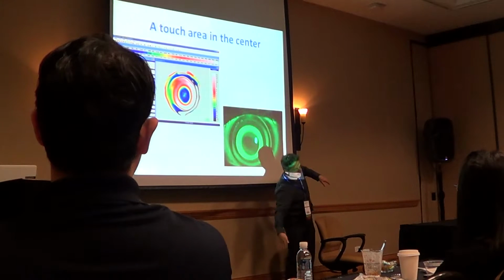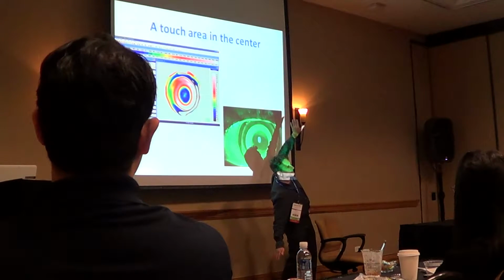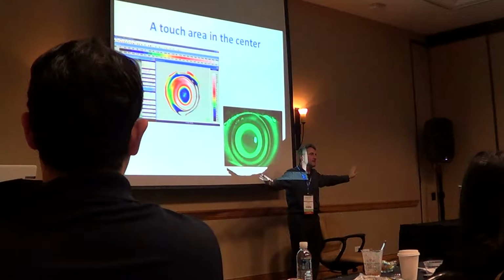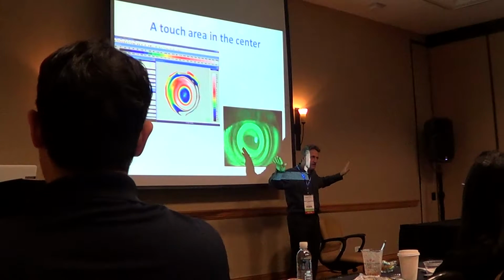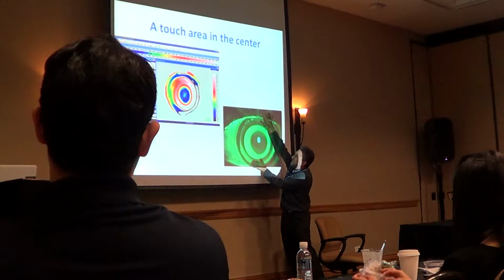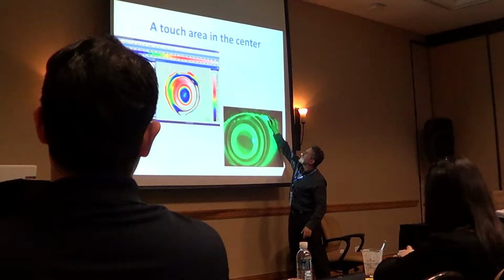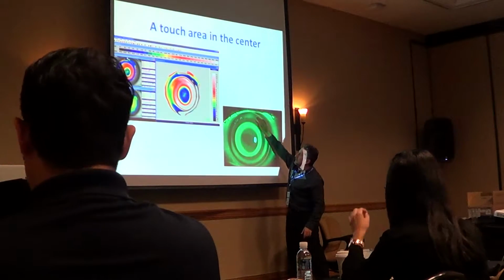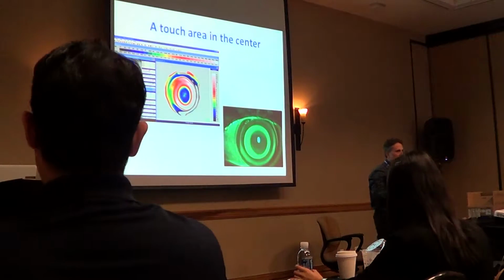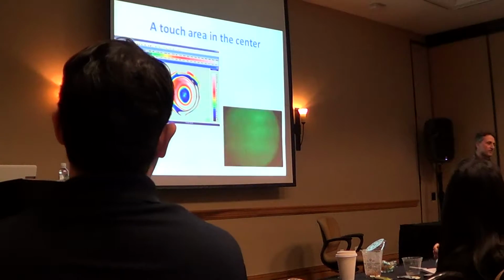Here the lens is touching and the opposite side the lens is rising like this. The lens is moving like this. So if you center the lens, you will have similar flat alignment. So horizontal is too flat, it's touching the center. Now, up and down, you see some green here and again here. Okay? So in vertical it is as well a little bit flat. Not so much, but what we need to do here? Add the diameter. Diameter maybe is quite small.